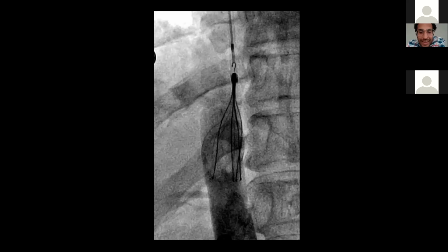So what did I do? I put a filter back in. So again, this guy woke up. I promised him the clot would be out, but I told him that we took the filter out, the clot didn't go anywhere. So we put the filter back in. So we're actually back at 1.